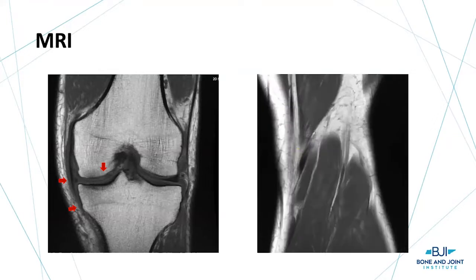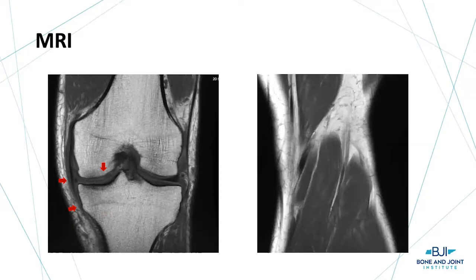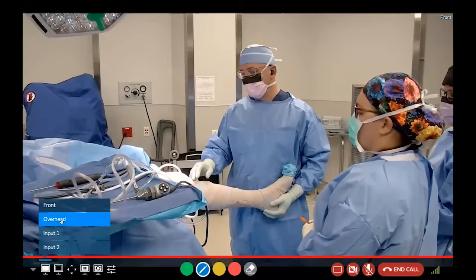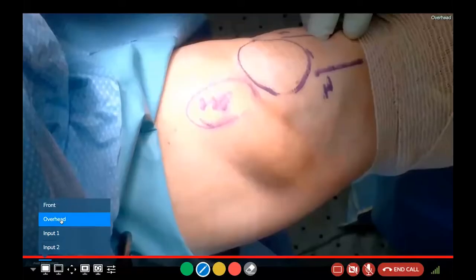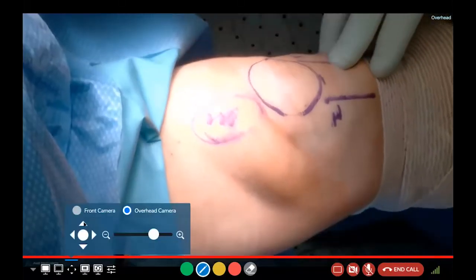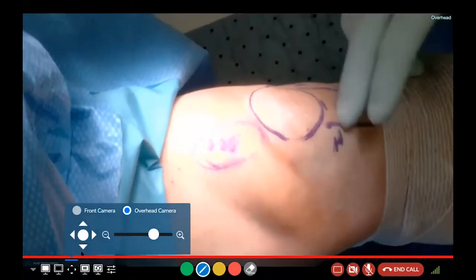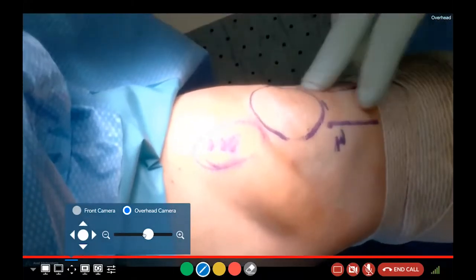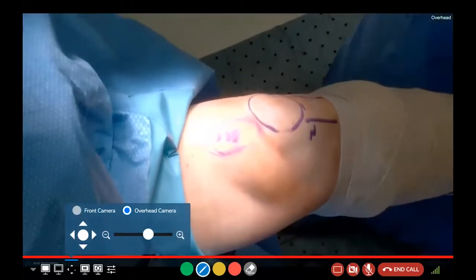Let's go into the procedure now. I've marked out the kneecap and the patellar tendon. Knee arthroscopy is really performed going on either side of the patellar tendon underneath the patella. That's how we'll access the joint.